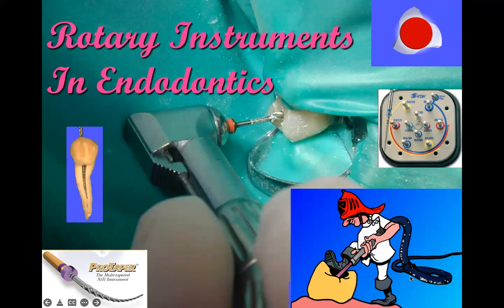all the three dimensions. There have been numerous concepts, strategies, and techniques for preparing root canal system from the beginning of modern day endodontics. Throughout these decades, a number of files have emerged for negotiating and shaping canals. The first endodontic file was crafted by notching a round wire at first from watch springs and then from piano wires in the mid 1800s.